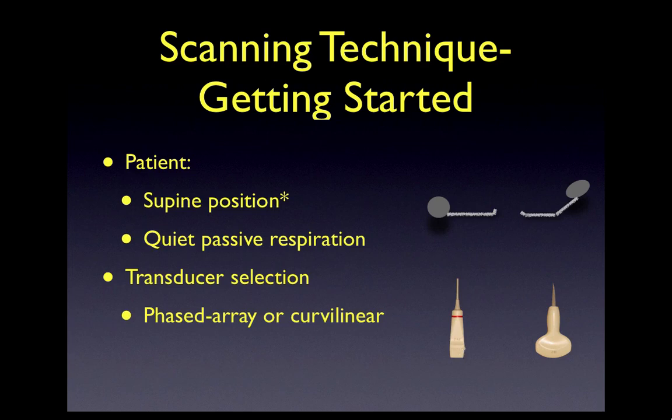First of all, when we perform an IVC study, we commonly couple it with a point-of-care echo. The phased array transducer is the transducer of choice for performing a point-of-care echo. So it will be one less step when you want to go from your echo to your IVC study. In addition, if you have to perform an IVC study by the right intercostal approach, the small footprint of this transducer will enable you to readily sneak between the ribs and visualize the IVC.